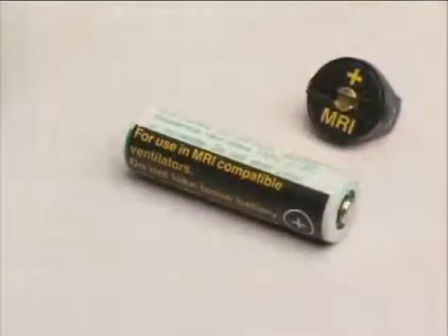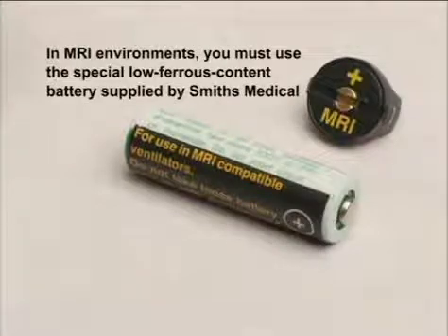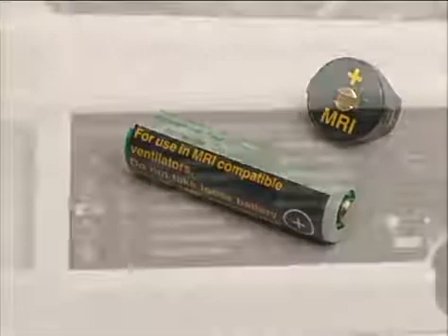A battery compartment on the right side of the ventilator houses a single-cell lithium battery that powers the electronic alarm unit. In MRI environments, you must always use the special low ferrous content battery supplied by Smiths Medical and marked for use in MRI-compatible ventilators. This battery comes in double A-size packaging that provides 3.6 volts and has a non-metallic casing. As a result of its minimal ferrous content, this specially selected battery produces no adverse effects after installation. Be sure to use only this battery.